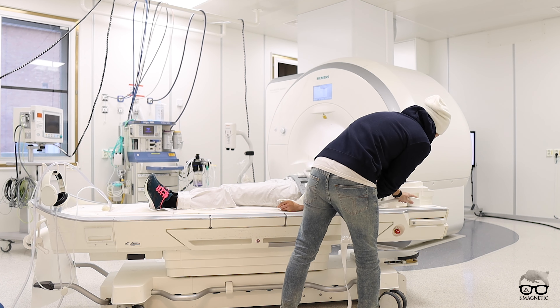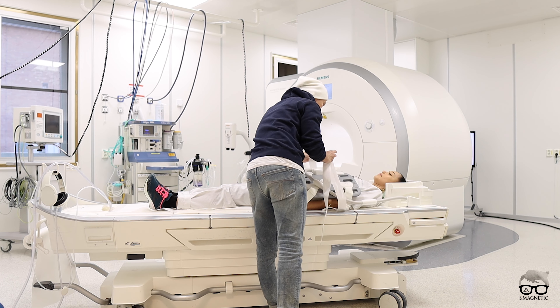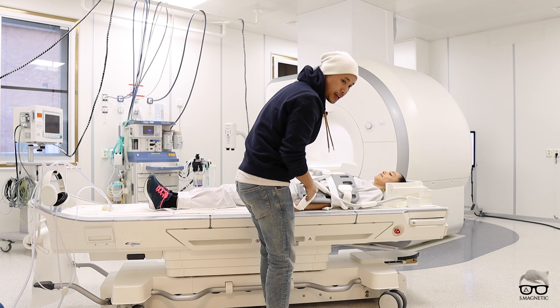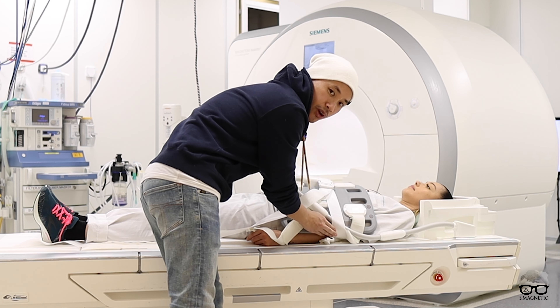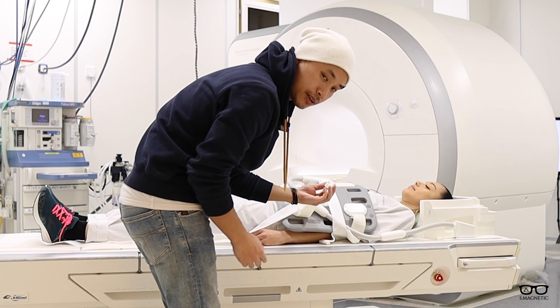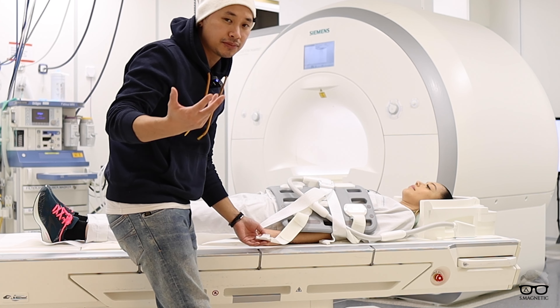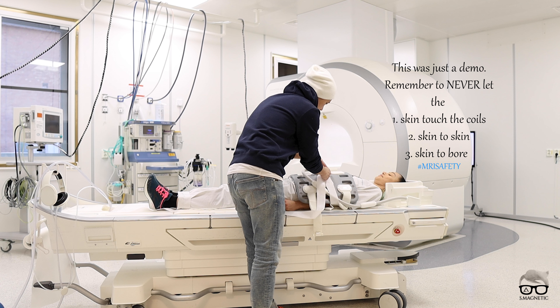Let's say I'm alone here and I want to work fast. I'm putting this body coil over here for limb imaging — like that — and then I only take this strap on both sides and just tighten it. The good thing about this is that the arms are close to the body and the coil is wrapped very well around her body, instead of using time to fasten and fold these on both sides. So I'll be working much faster.